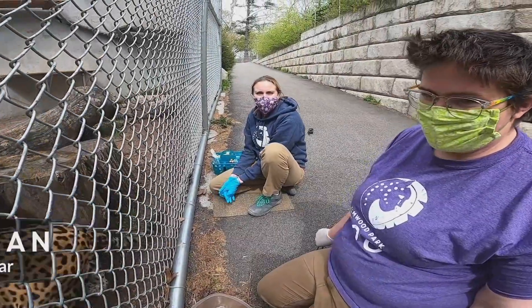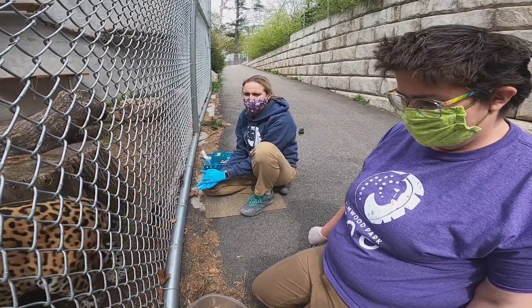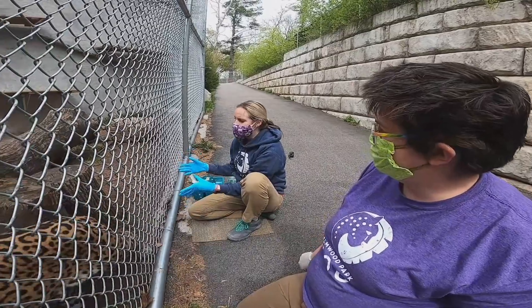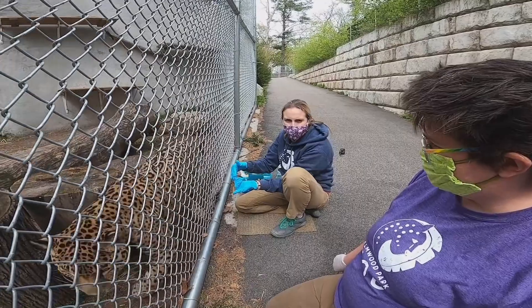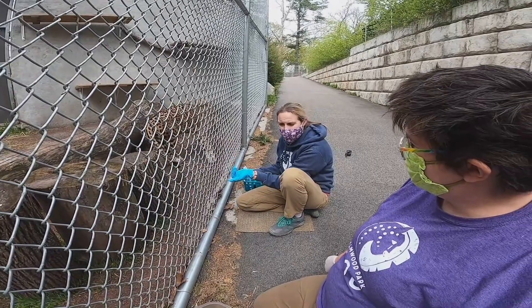Today we're going to try to get a little bit of blood from Zian, our male jaguar. How we do blood here at Elmwood is through training. We are here with Zian's trainer Mel, and what we do in this setup is we ask Zian to line up between the fence and the log. He holds that position, and then we give him a cue that tells him we're going to touch his tail. He holds his tail still, and then I'm able to draw blood from it.